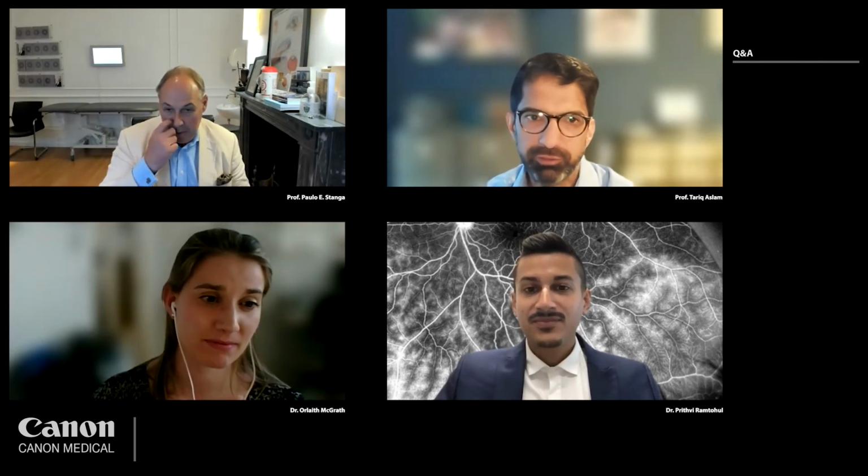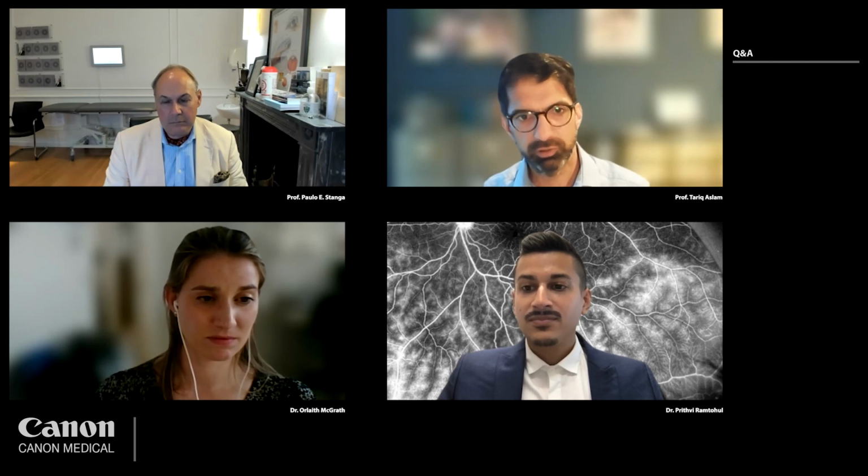I'll answer it then. So I think it's a really useful tool, as well as the macular OCT-A. I'm really keen on the wide field OCT-A as well for the diabetic patients, for identifying those with neovascularization. And we're having a problem with occasionally people can have things missed. We don't get fluorescein angiograms on the same day in clinic, like in some places. So being able to shove them over, get an OCT-A and see very clearly this neovascularization, and then they can move straight to laser, I think is a really useful tool. So to my mind, it should be a part of every retinal practice, and it's what I'm trying to convince people of.